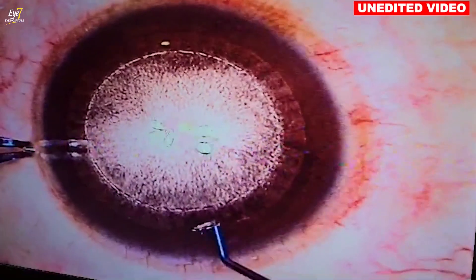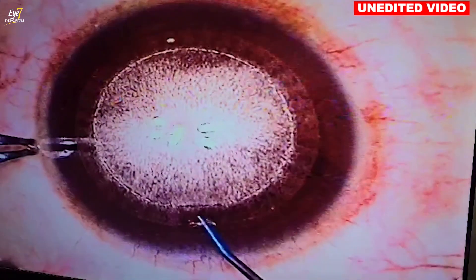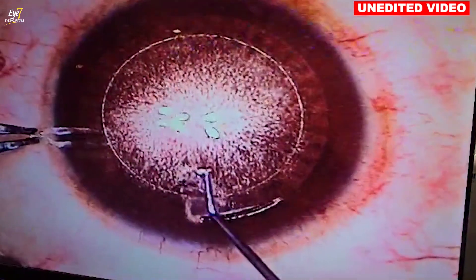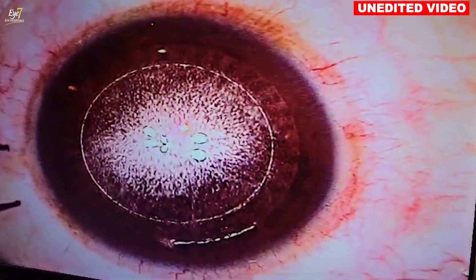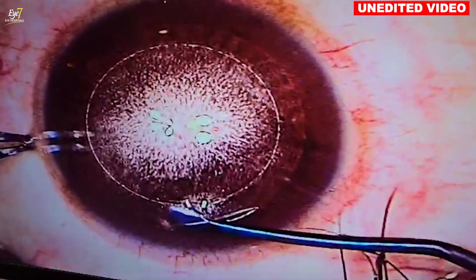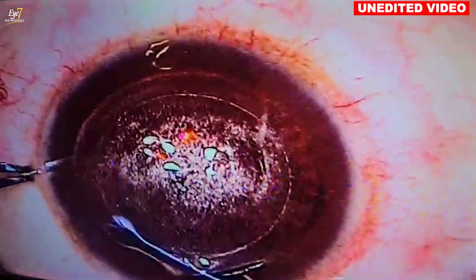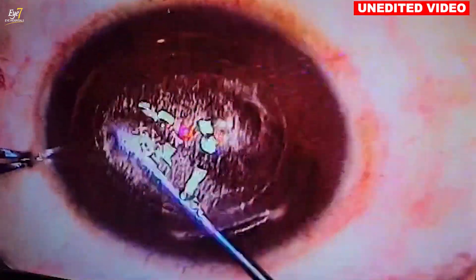Opening the entry cut now. Understand that it is a bi-convex lenticule, so we go in slightly at an angle to open the anterior plane, and then we open the posterior plane. Just look at the beauty of this procedure — there is a reason why it is called SILK. The dissection is virtually like slipping your instrument through the interface; it is actually like silk. The name is truly relevant to the technology. Anterior plane done.